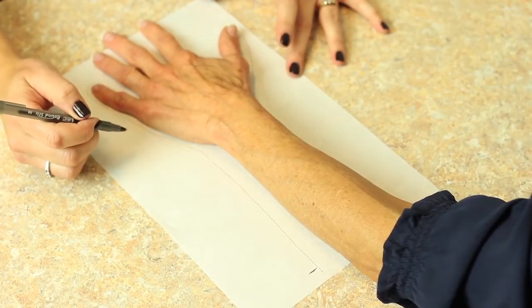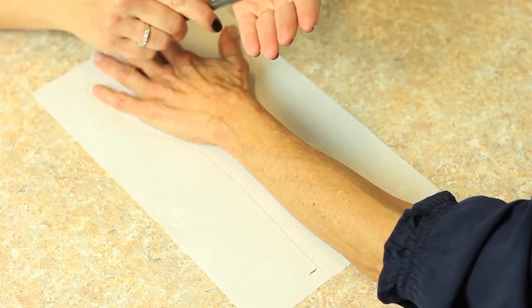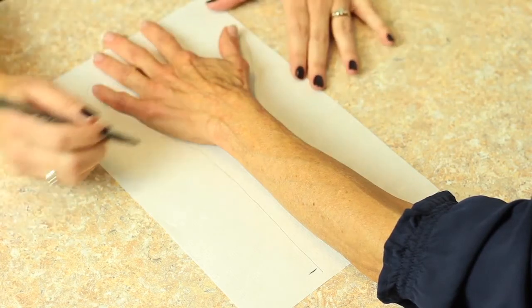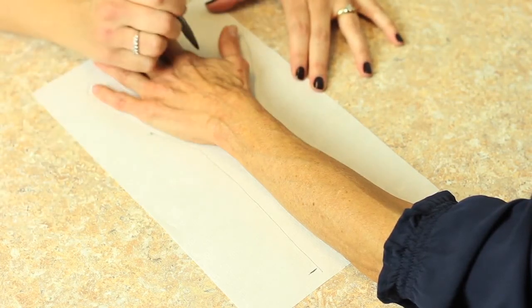Distally in the hand we want the orthosis to end just at the distal palmar crease to allow full MCP range of motion. So I'm going to mark for the second and the fifth MCP.